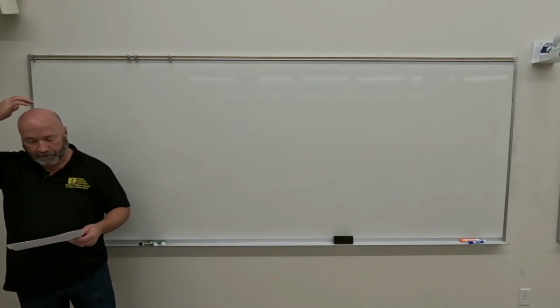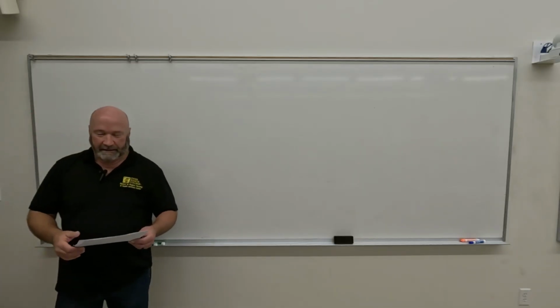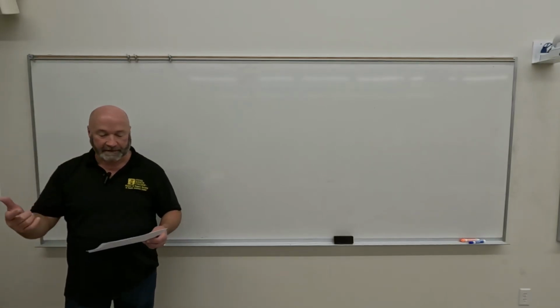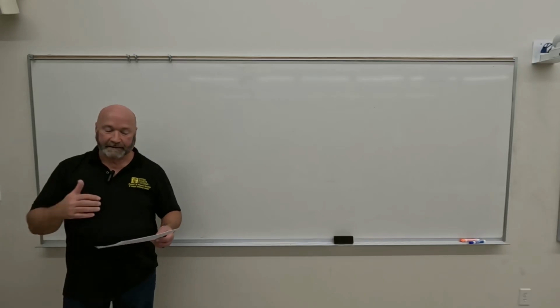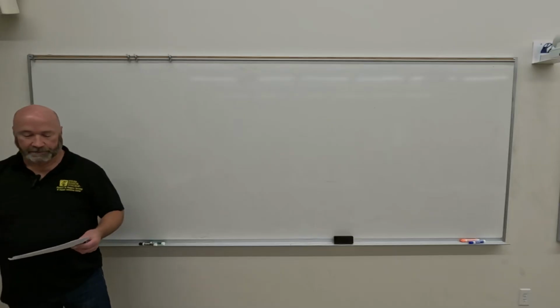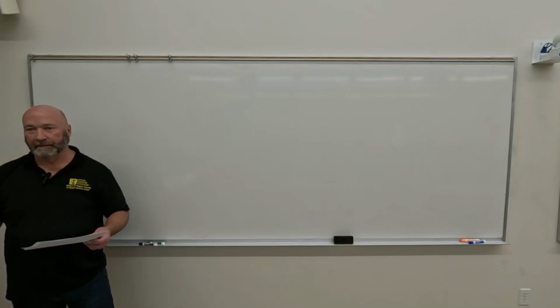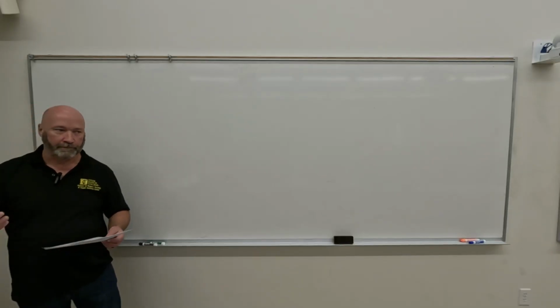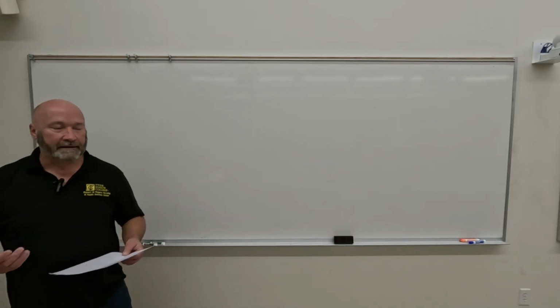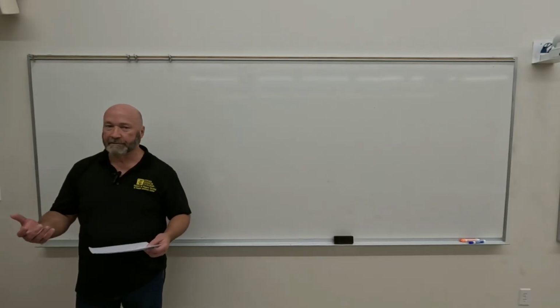Very, very flexible. We had floor mounted systems which just run on tracks, a little unstable, very limited in what you could do with them. Then we have floor to ceiling mounted systems, still as limited as the floor mounted systems, just a little bit more stable. And then we have C-arm systems, which come in a couple of different varieties. Most of the time they're going to be those portable fluoro units, or even stationary fluoro units, like what you would see in interventional radiography and interventional cardiac catheterization, but especially in special procedures.